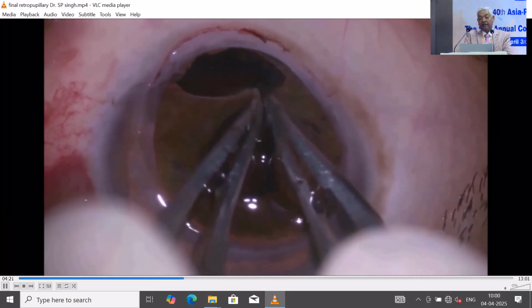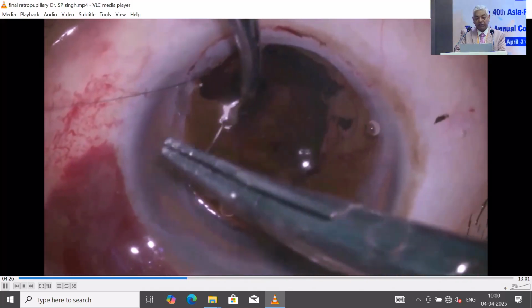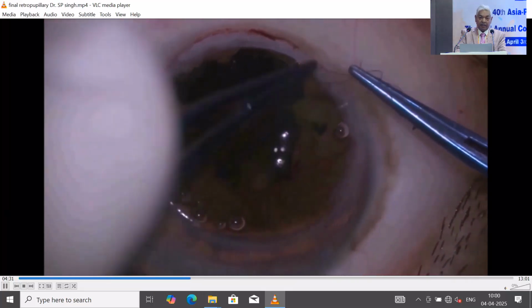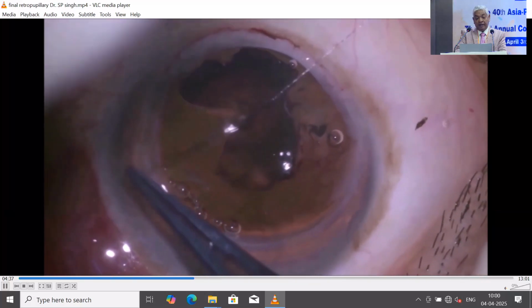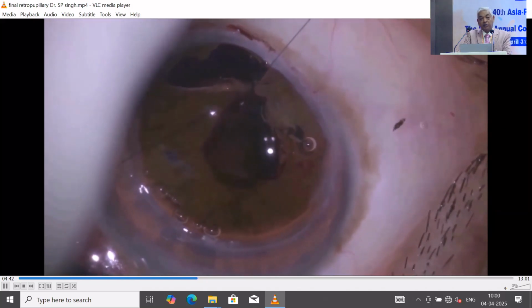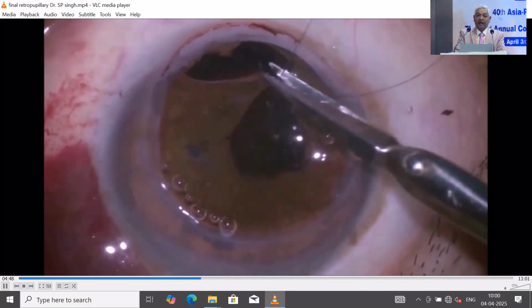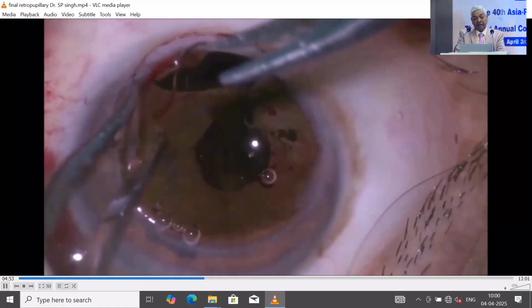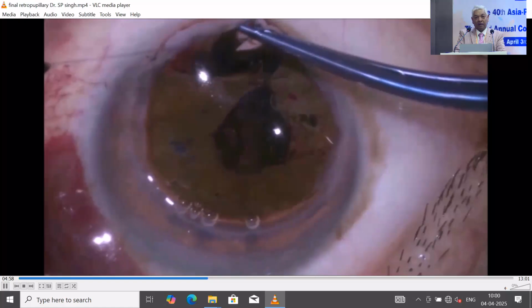You can see the repair. In every individual case you get a different technique of pupilloplasty or iris repair, and you can see how in such a defect you can repair the pupil and make an appropriate size of pupil. Once you see different complicated cases, you can also decide what to do, and anybody can do the complete surgery and repair in such a case. Then from the remnant part of the periphery, you can repair in this direction.